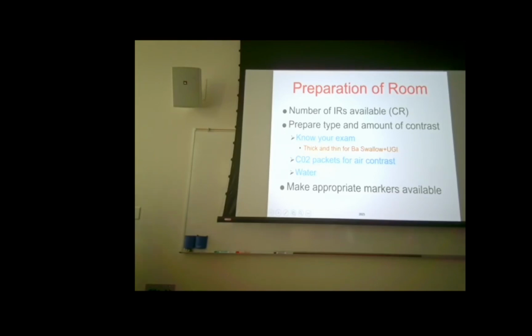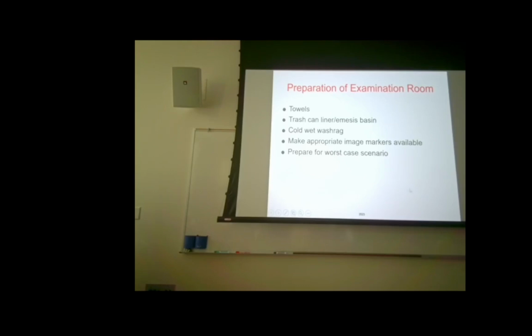Again, have some water available. The CO2 packets, everybody seen an upper GI at this point? Anybody not? Not to put anybody on the spot, it's not your fault if you haven't seen one, we just don't do as many. Okay, well, the CO2 packets are what a lot of the texts will refer to as the fizzies, introduce the air that provides the air contrast. Okay, so make sure you have some of those available as well.